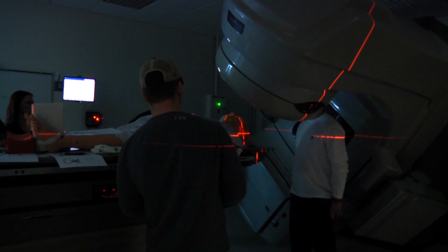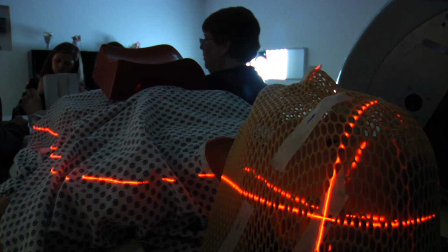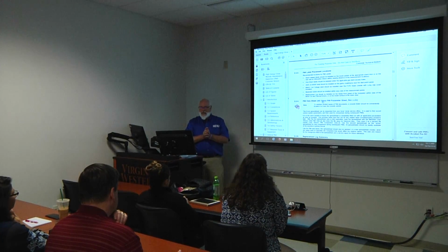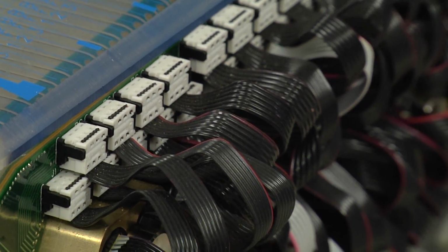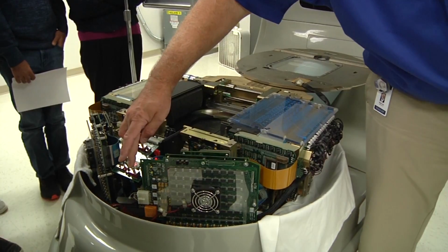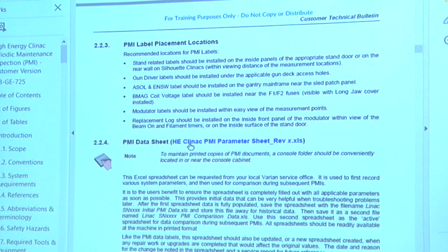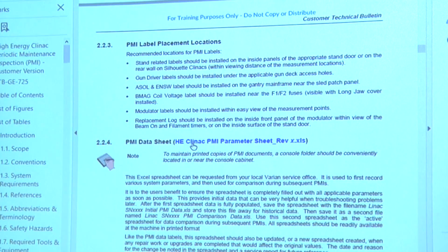Any component that's in a radioactive environment will degrade quicker. So all of the circuit cards in the room, after a while, will just deteriorate because of the bombardment of radiation. All of the plastic in the collimator, all those little tie wraps, all of a sudden they just start to disintegrate. Well, the insulation on your wires does the same thing. So older machines are a little bit more fragile than newer machines just because of the radiation damage. You want a new cell phone? Put it underneath the head of the machine and beam on for a while. Destroy all your electronics. So those are just things to be aware of.